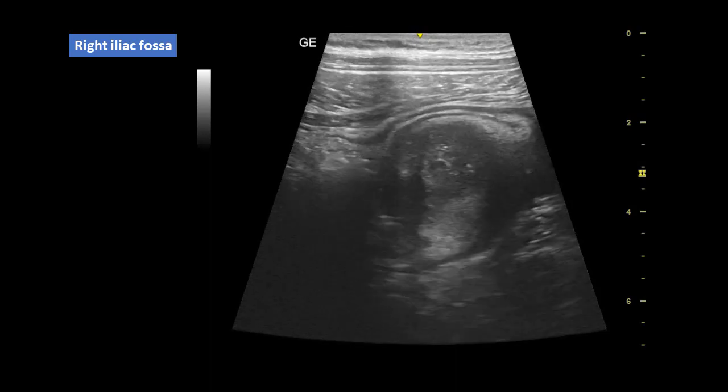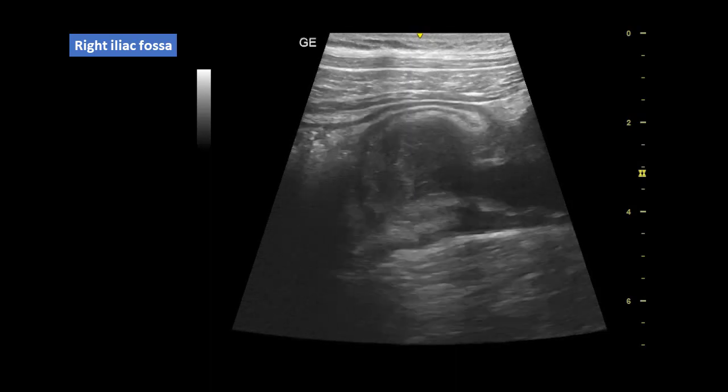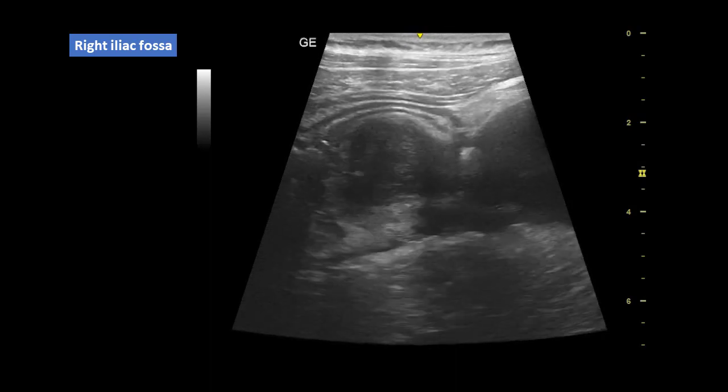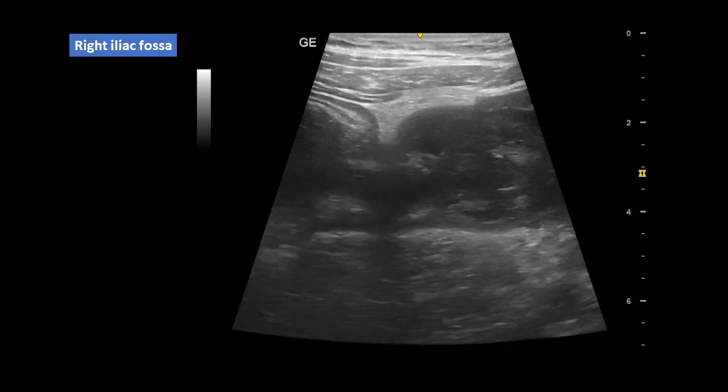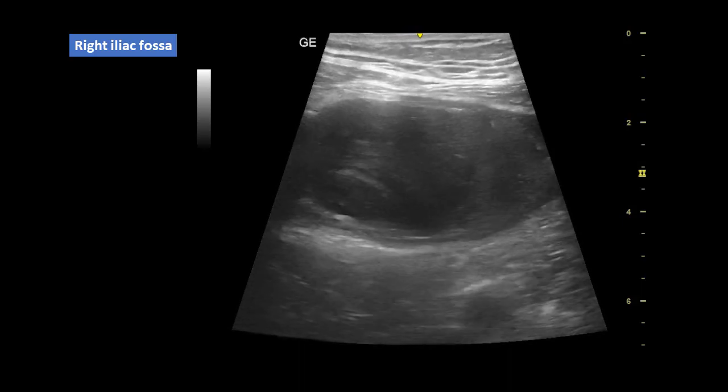Here are cine clips of ultrasound examination through the right iliac fossa. What is your diagnosis?